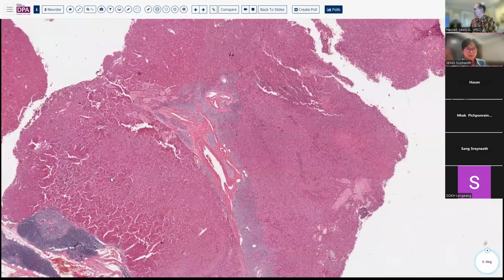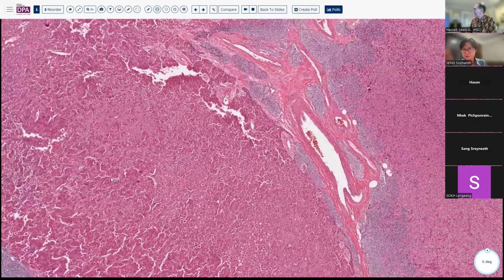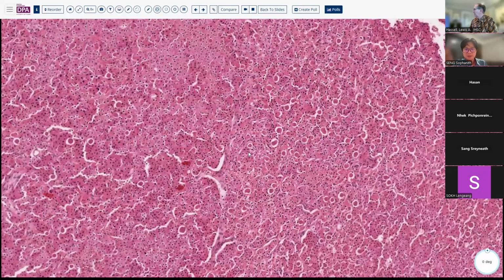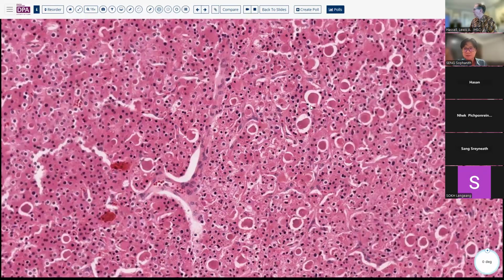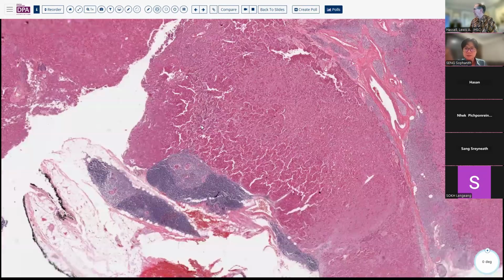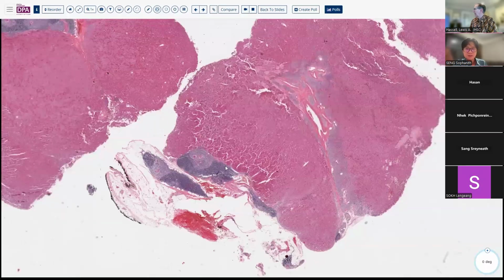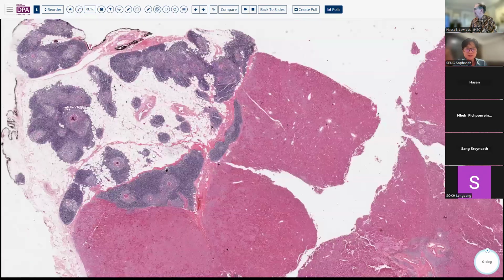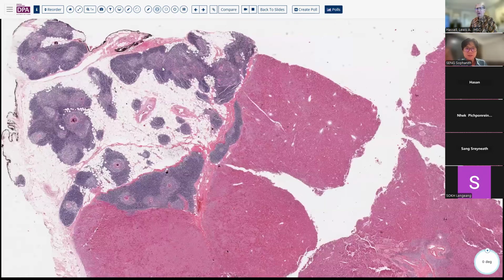And so this is a nice example of a parathyroid adenoma, as you can see, very enlarged, very monotypic in sense of very oxyphilic cells with a few small follicle structures that is occurring in the thymus. And based on the cellularity in this thymus, you might suspect that this is not a child, but also not quite an adult with a completely involuted thymus.